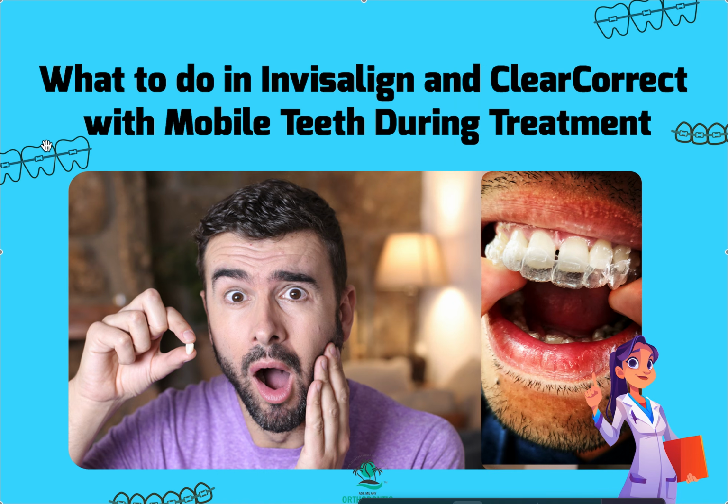Next thing we have to keep in mind is we have to check the occlusion. We're going to use articulating paper. We're going to see if there's any premature contacts on those teeth that are mobile. I'm going to take those teeth temporarily out of occlusion. So if we're getting to the point where we're starting to get mobile teeth, first thing I'm going to do is check the bite. I'm going to take those teeth out of occlusion. Yes, I'm going to have to get out my handpiece for that. But you know what? Better to quickly get it out of occlusion than to have problems with mobility.